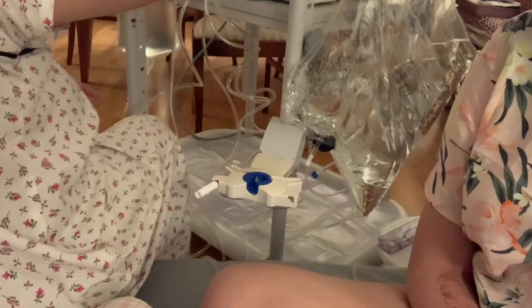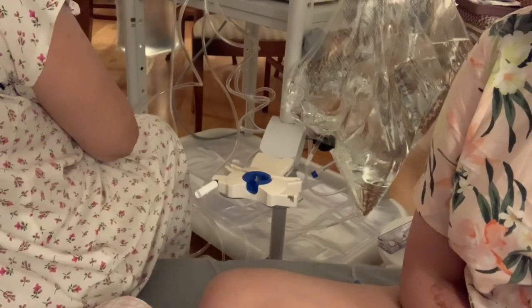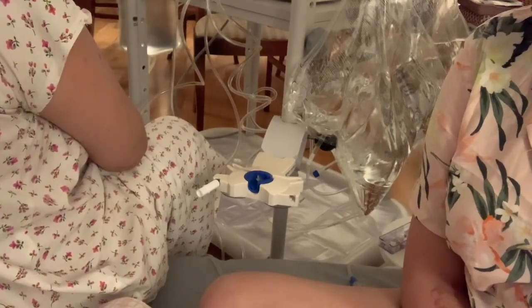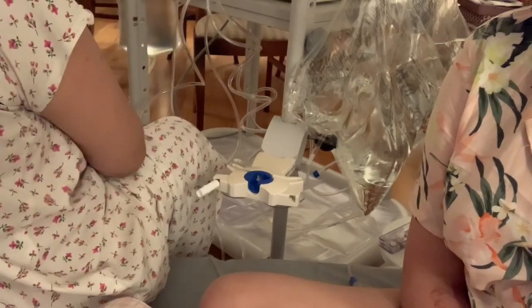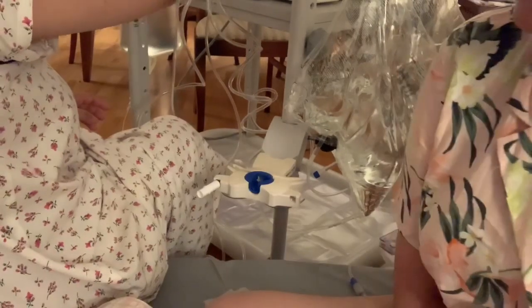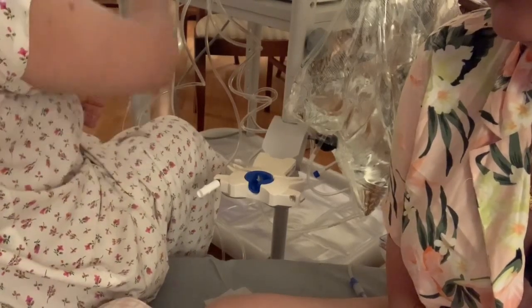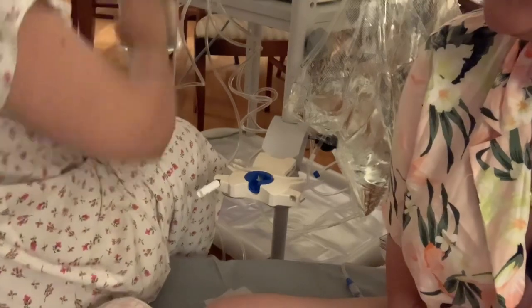It looks fine — I think you should try one more time. I got over a thousand but I'll try again. Now I'm starting to feel that it's getting less and less because I can feel it sucking. How much did we get out? 1,028 ml. Now it's all empty — and it feels nice to be empty.